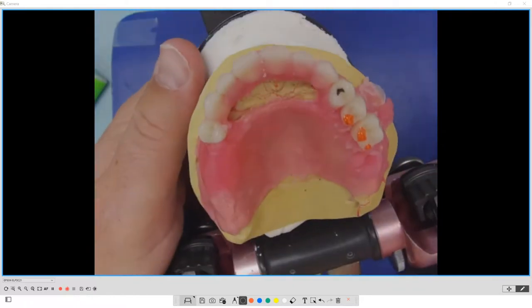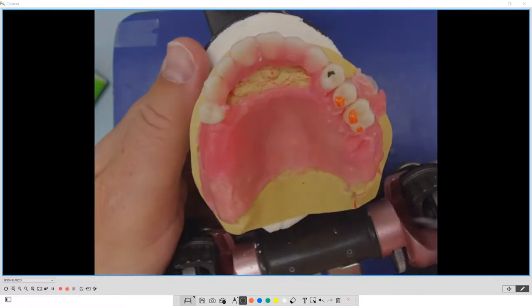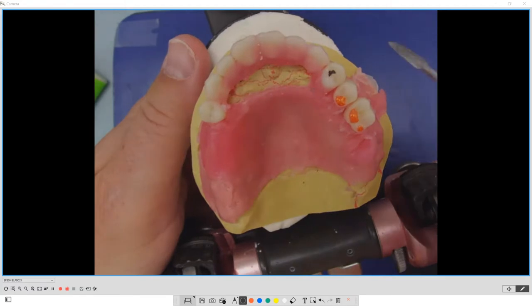That's how this works. Natural occlusion is based on a mortar and pestle crushing. Lingualized form teeth are the same principle. They're a crushing tooth, physiodense, crushing, even MFT, crushing. This is not milling. Yet most of the occlusion that we've been doing and that we taught ourselves has been milling.